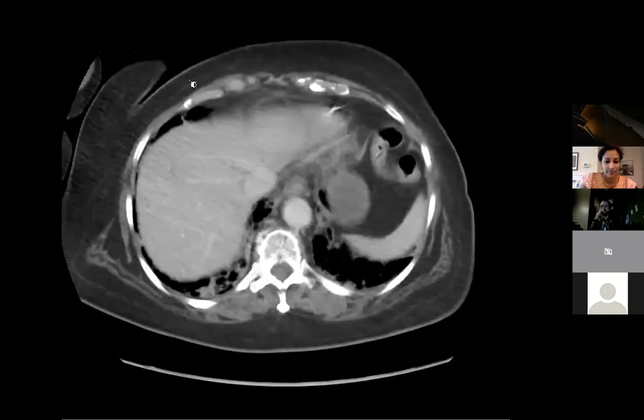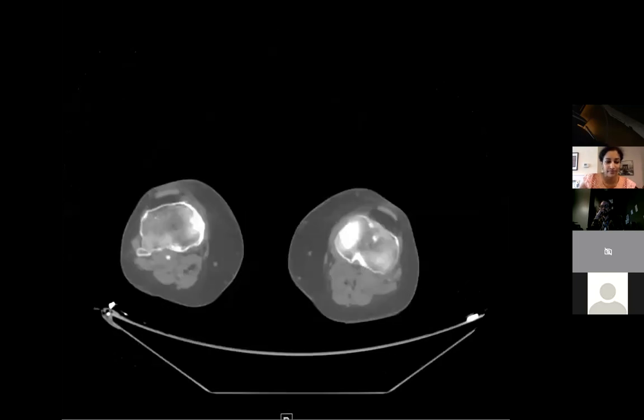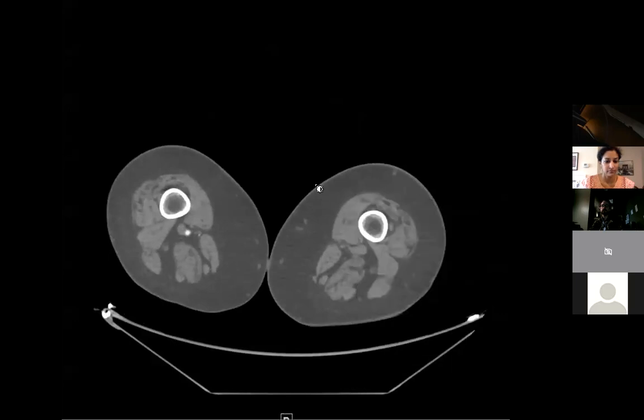Right. So let me show the second case, because they're kind of the same. Just as background, we've seen a lot of cases where patients come in with just abdominal pain, and there's nothing on CT of the abdomen pelvis, but the lungs are clearly COVID. So at least in our experience, that is a more common thing that we saw. Just tremendous abdominal pain, and we don't see a lot of findings except for the lungs. But recently we've seen several of these patients. This is another patient.